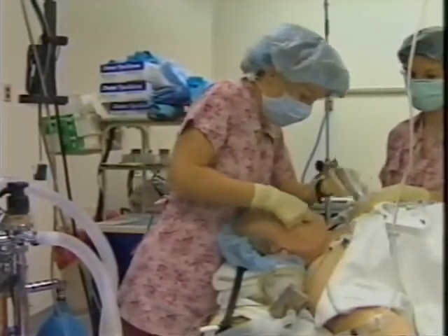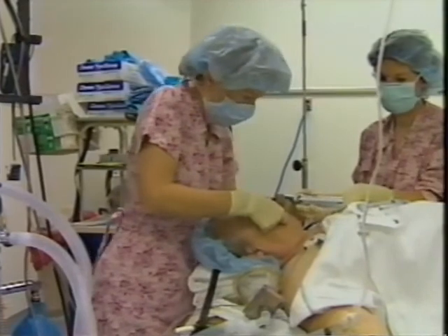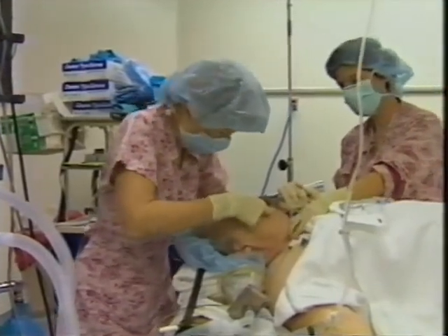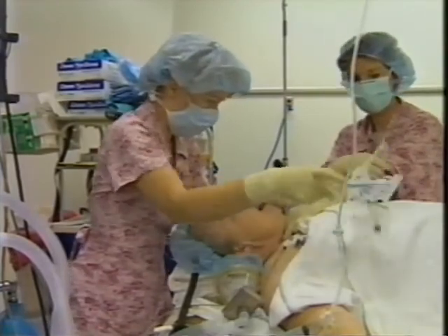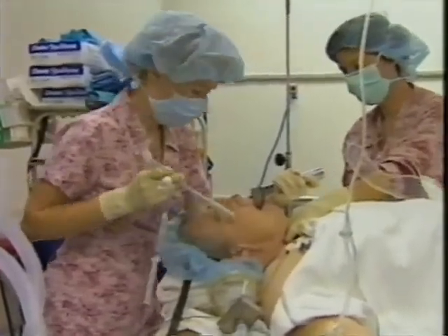Complications can occur even with perfect medical management, and you must know how to recognize and to treat them. However, preparation, gentle technique, and attention to total patient well-being minimizes the risk.